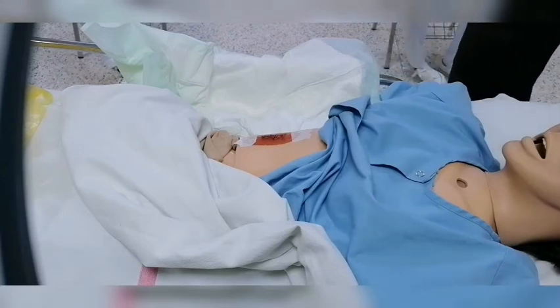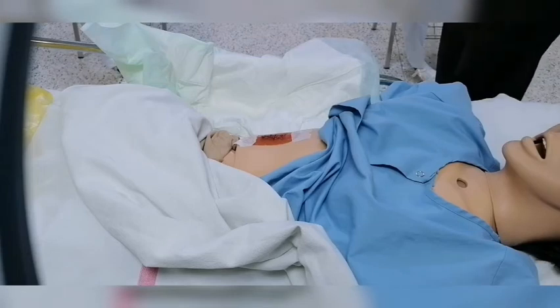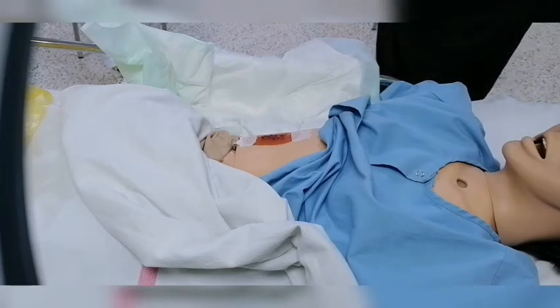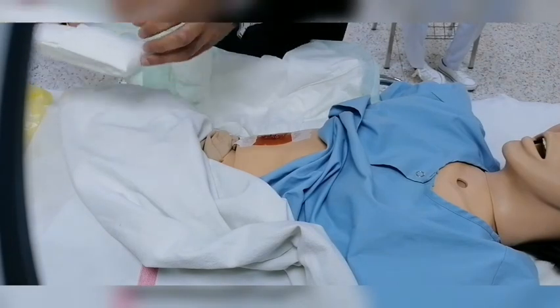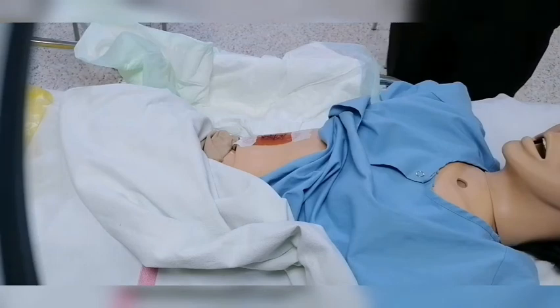Then I will open the dressing set without touching it with a bare hand. So I can use what we call the non-touch technique for opening of it.